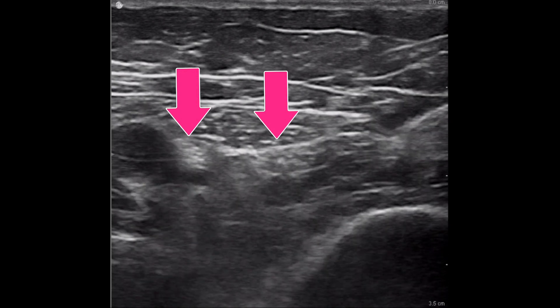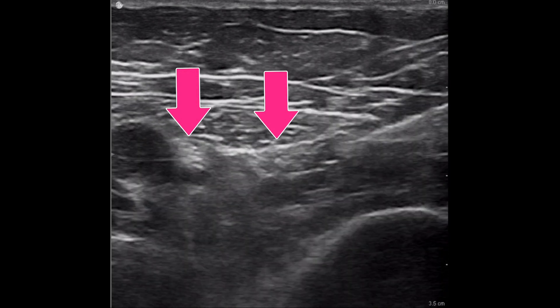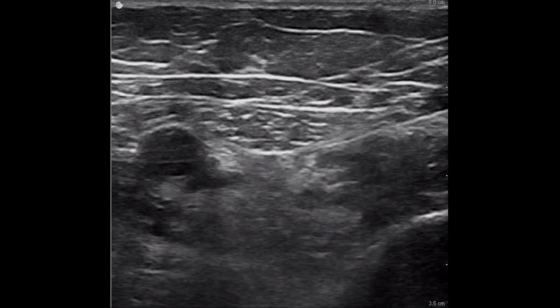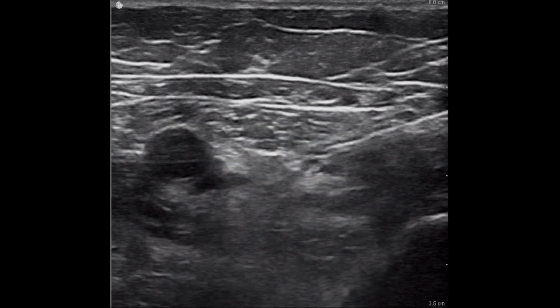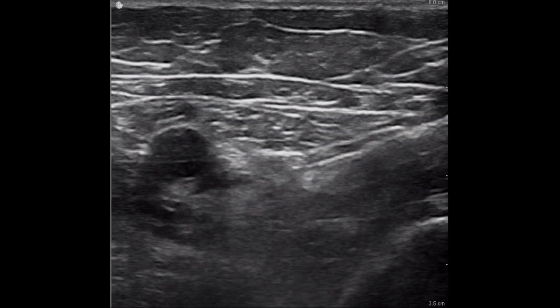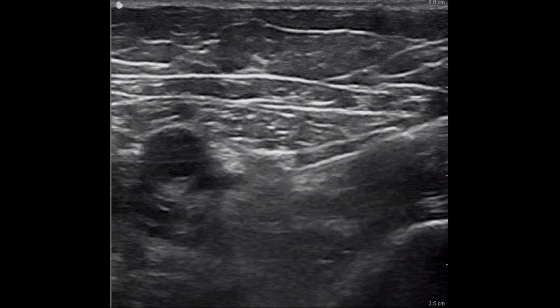Here we see two hyperechoic structures on ultrasound. The one on the left is the saphenous nerve. The one on the right could be the nerve to vastus, but it could also just be an artifact. For that reason, we use a nerve stimulator to evoke a motor response of just the medial vastus head, which can be felt on the medial knee as the needle approaches the nerve. The use of nerve stimulation has both a safety and an efficacy rationale: it ensures you don't accidentally hit the nerve or the artery, while ensuring you correctly identify it and administer local anesthetic around it.